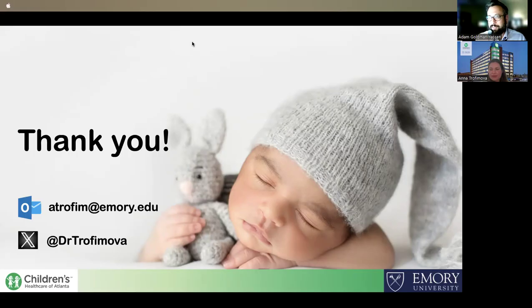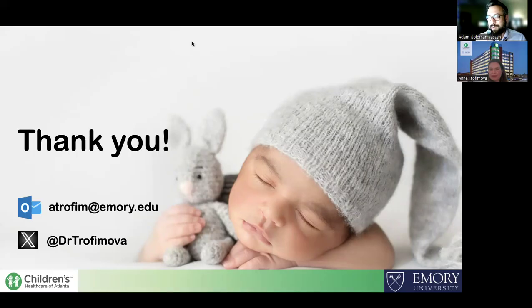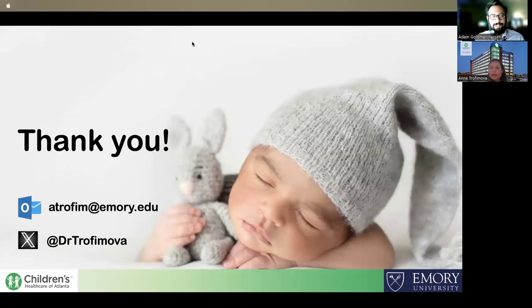Meaning that the spectroscopy looks different. A normal spectrum looks different in a neonate compared to an adult. Of course. Yes, of course. So yes, it's going to be age adjusted for that specific neonatal age group.